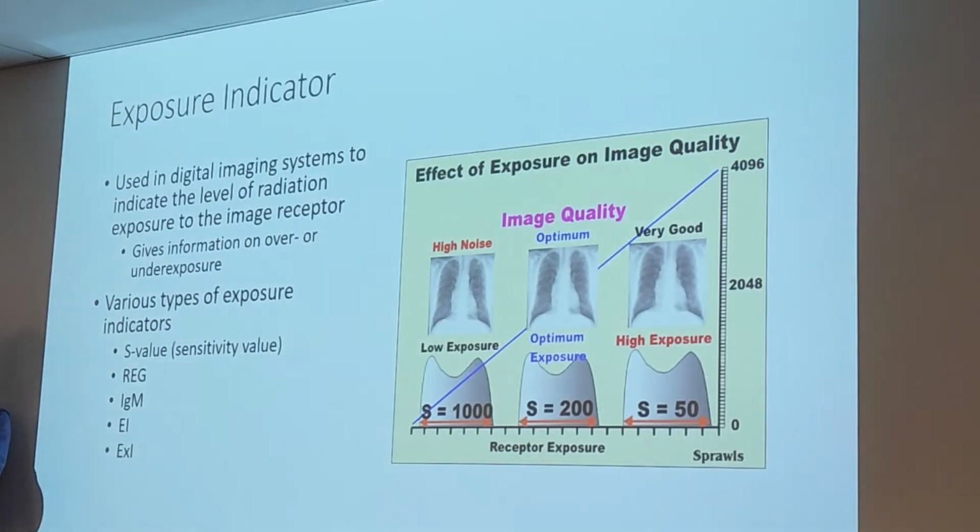For a chest X-ray inside the room, 72 inches with the grid, S value is expected to be between 200 to 600. On the other hand, tabletop, outside the bucky, cassette, 40-inch SID, 85 kVp, 3.2 mAs like a portable, your S value range is between 100 to 400.